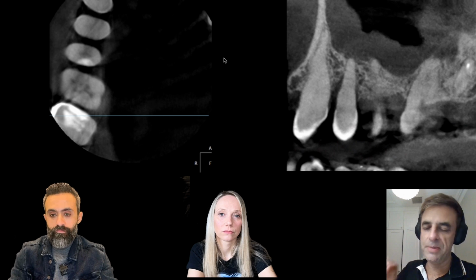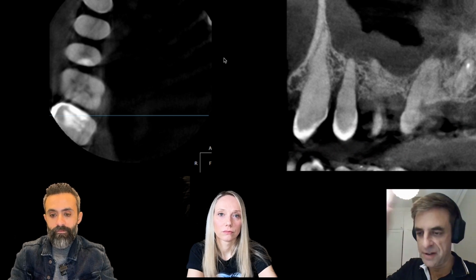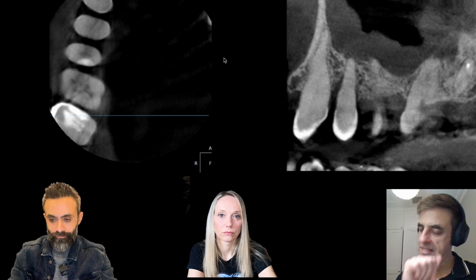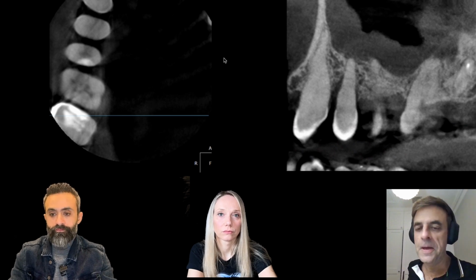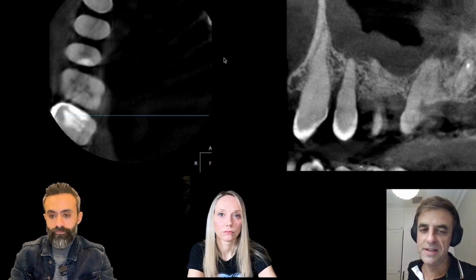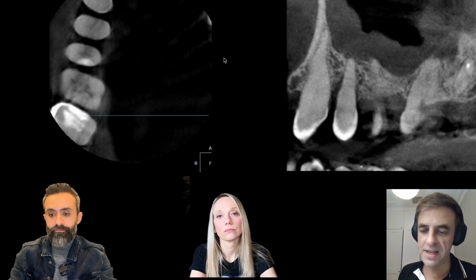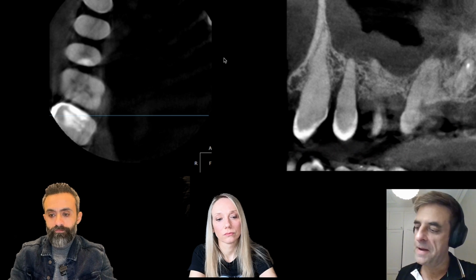And so when you get that, you locate that with the software, and you go to the sagittal view, and it'll show the bone's good, and then it'll show in two slices there's a V defect, as you can see on the right hand side here with the V. There's a V defect in the bone, so you know that the crack now involves the alveolar bone, and unfortunately, it's one of those teeth we have to say to the patient, we're going to have this tooth removed.